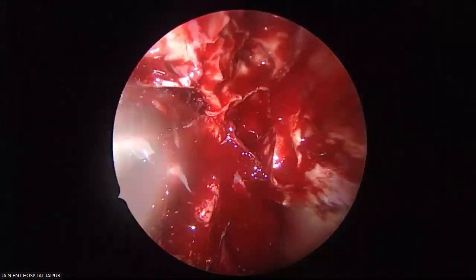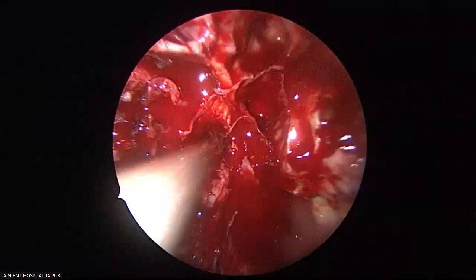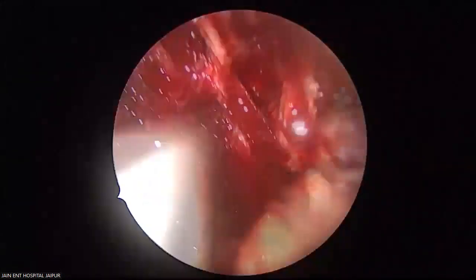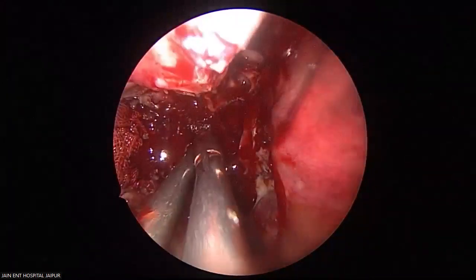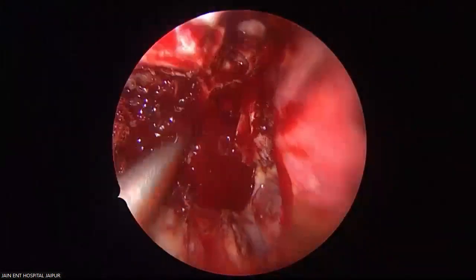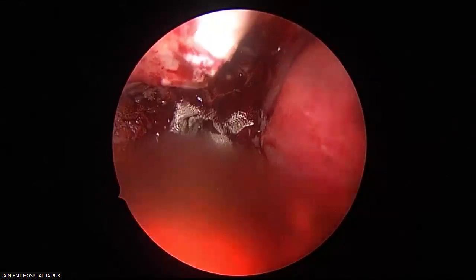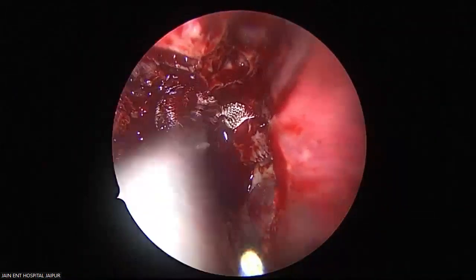Okay, perfect. Now I will suggest, I will remove that. The pull has to be very gentle, Dr. Satish. Very gentle, very controlled. Because if you break it up, then it is a bit more tedious to take out that small part. And never pack hard with the Surgicel. You know, the nerves are in this. You never advocate packing hard in this region.